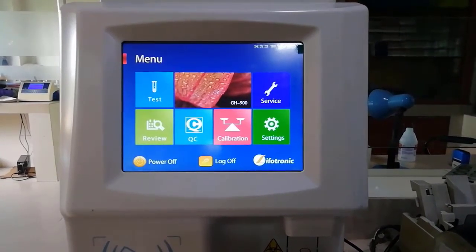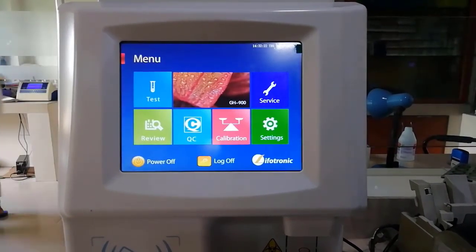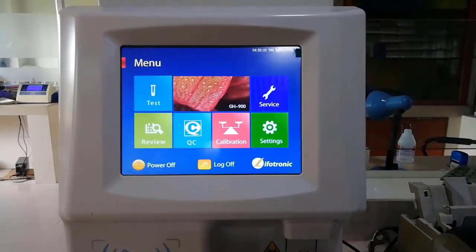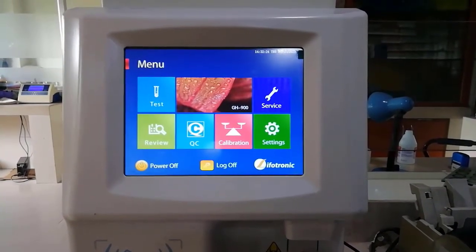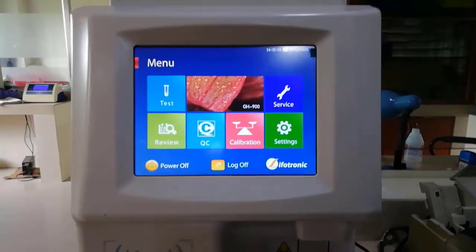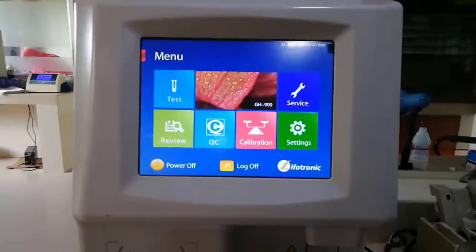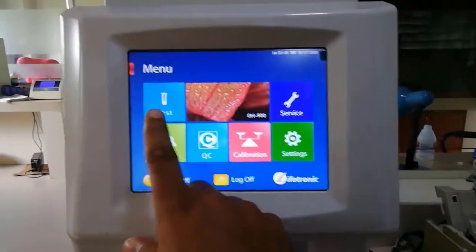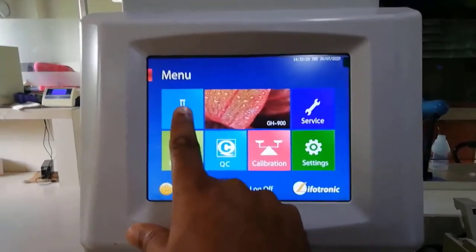We can select from the main menu: Test, Review, QC, Calibration, Settings, and Service.